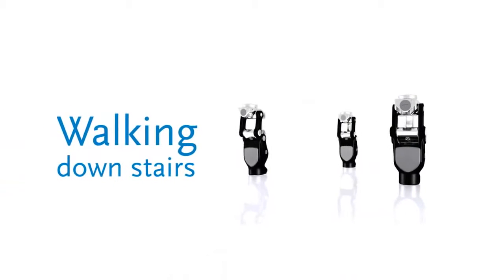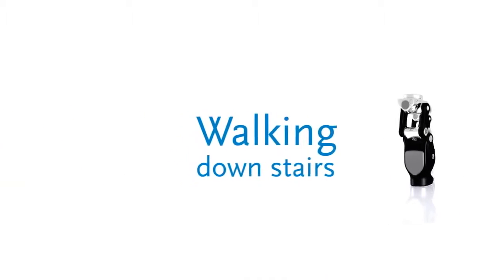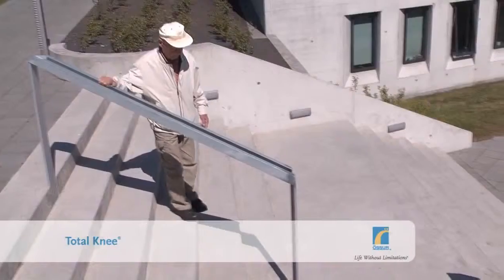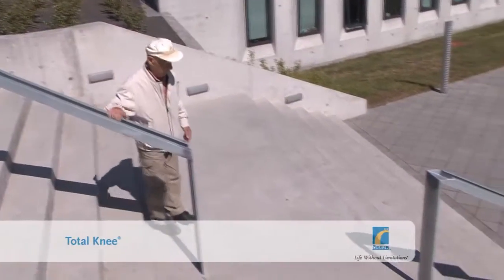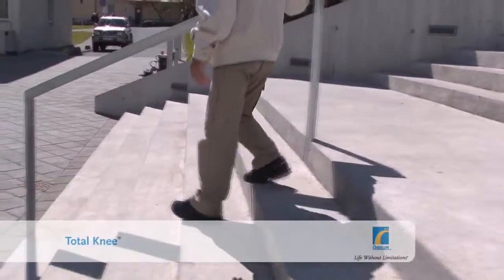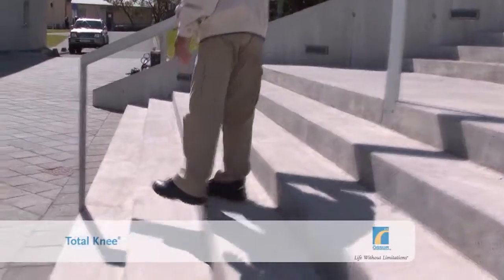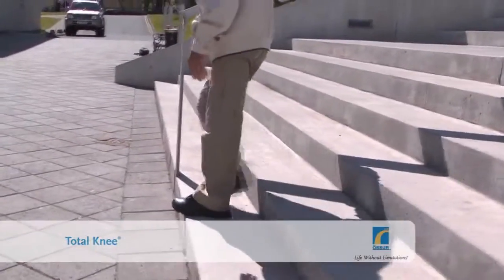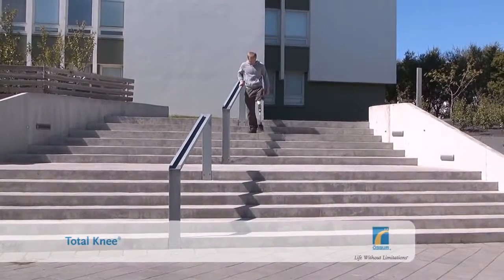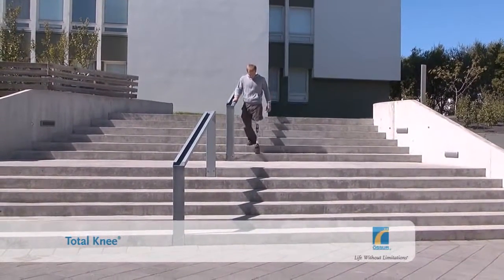Walking downstairs. Walking downstairs can take some getting used to, especially for new amputees. Compared to other mechanical knees, total knee offers some of the highest levels of confidence and security, but it is always worth using a handrail when going downstairs.